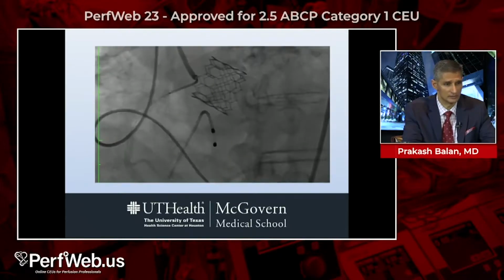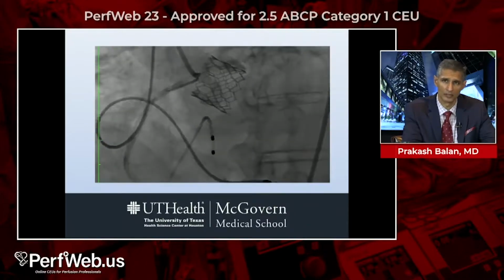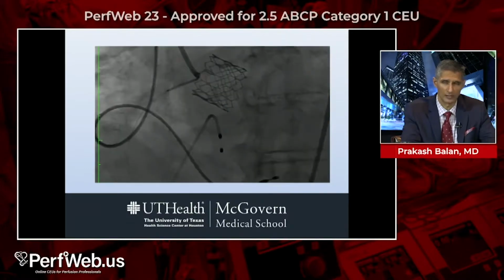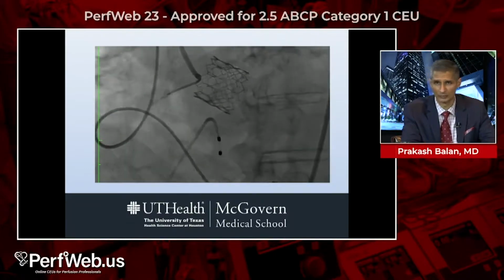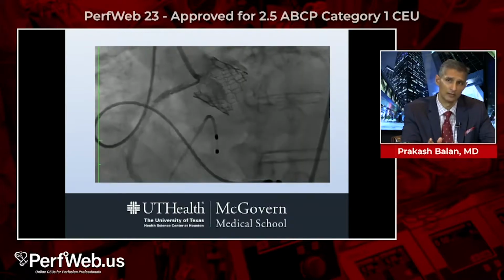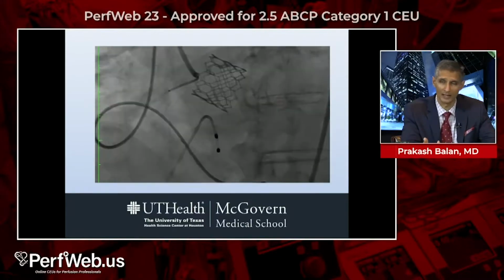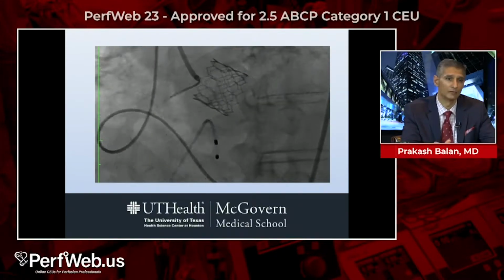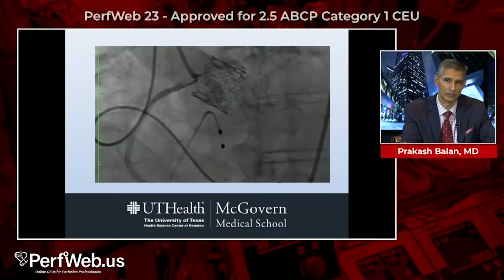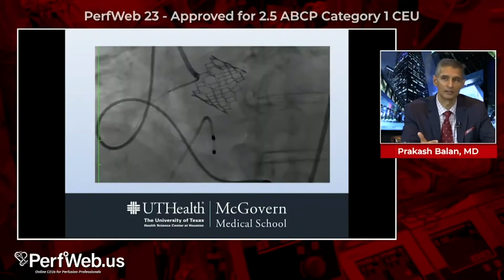Given the hemodynamic instability, the VF arrest requiring defibrillation, the low mean arterial pressures, we did all of this on VA support, 17 French arterial cannula, 23 French venous cannula. We had the stability to go ahead and do this intervention. It was not easy to engage this artery with the valve right there and the high anterior takeoff. However, VA ECMO provided us that opportunity to bail this artery out. Without that support, there would have been ongoing hemodynamic crisis.